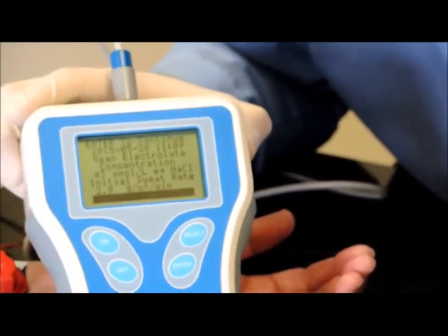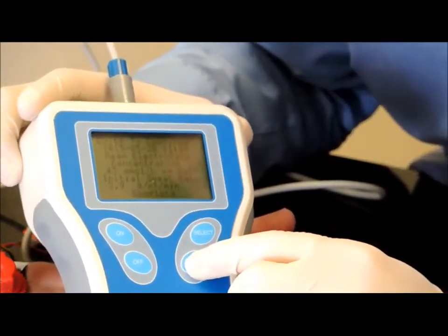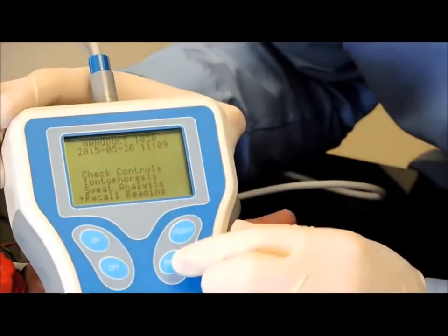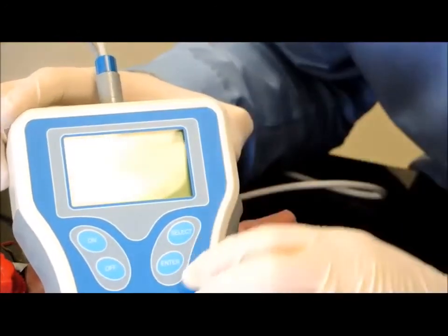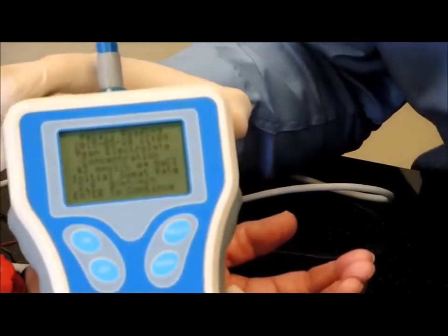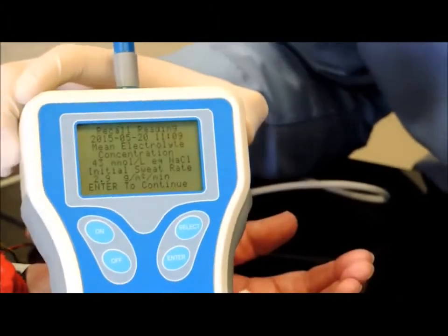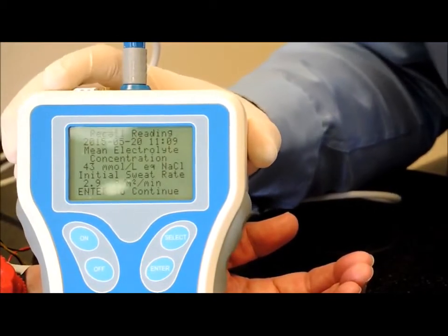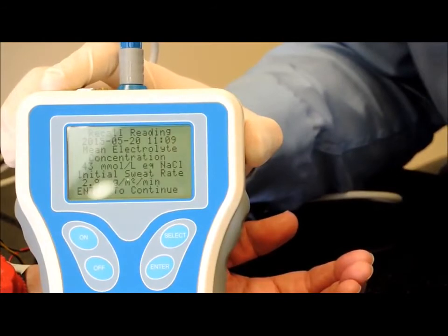Okay, now it's finished. It beeps at us, and it says complete. So you press enter, and it takes us back to the main screen, and you'll see an arrow that says recall reading. So I press enter on that, and it will give us the final reading. Her final value was 43, again with a sweating rate of 2.9. So that's the value that you would report back to the doctor for the sweat conductivity test.